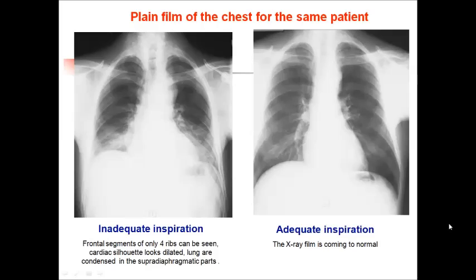Inspiration. Usually, before taking an X-ray film, you ask the patient to inhale as deeply as he can.